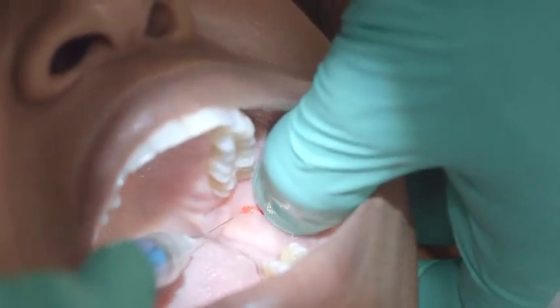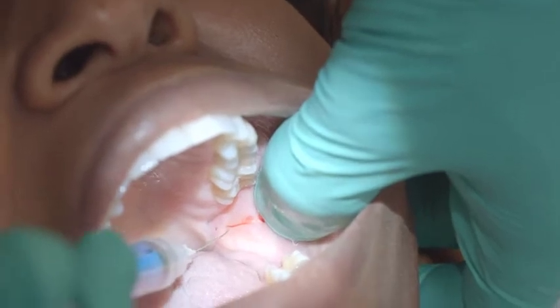Sometimes what I do is give just a little bit right there, right in the middle, just to make sure. And I rub it again — make sure it's all rubbed in.